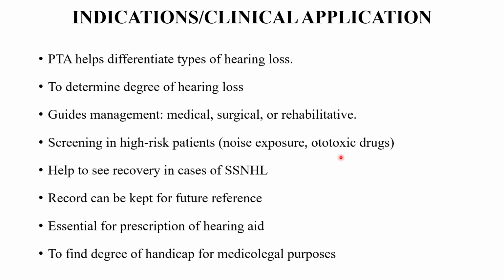So regular or annual audiometric evaluation is mandatory. It also helps to see recovery in cases of sudden sensorineural hearing loss. The records can be kept for future reference. It is an essential part for prescribing the hearing aid and to find the degree of handicap for medico-legal purposes.